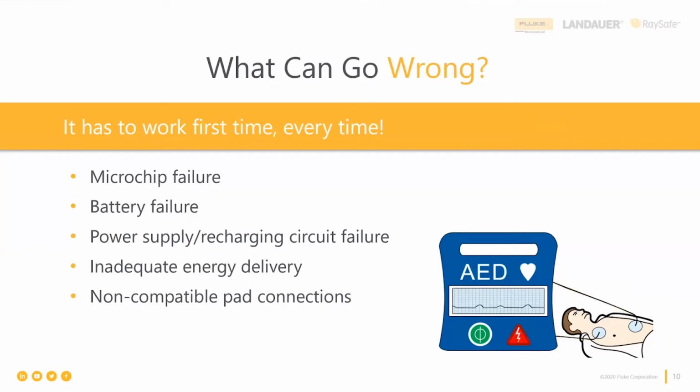Right. Now, typically, these are part of the supplies evaluation that the clinical unit or the response team is responsible for. There's a couple of different intervals for that, which include looking at the dates on the pads, but certainly once a month is not unusual. But for the biomed, when you go to do defibrillator testing, it's also your responsibility to take a look at those pads that are available on the top of the code card or wherever it is. Make sure there's eyes on those dates, and the battery as well. As Justin said, if somebody misses that and the pads are dry, they're not going to work.